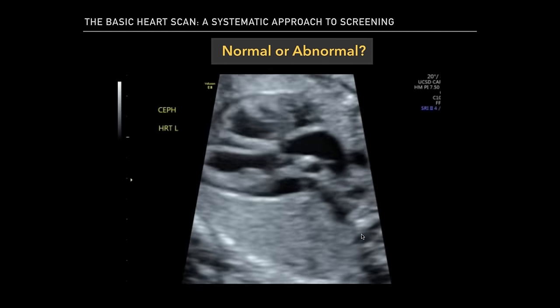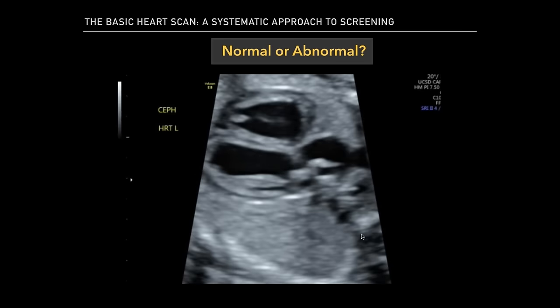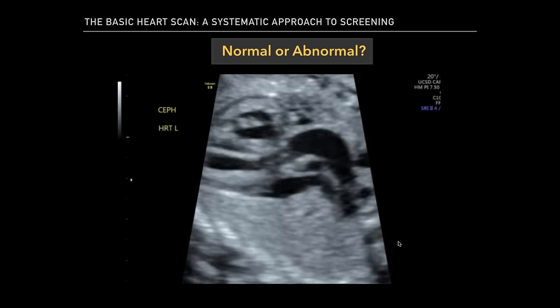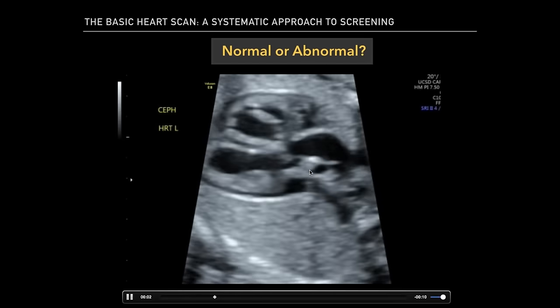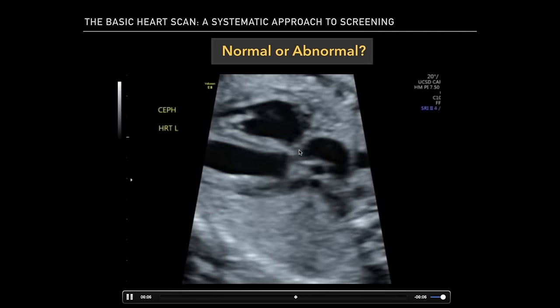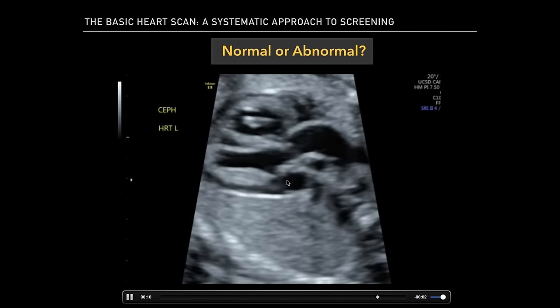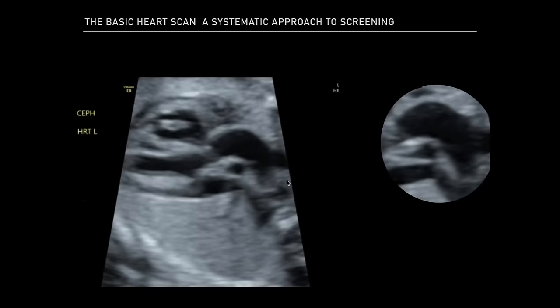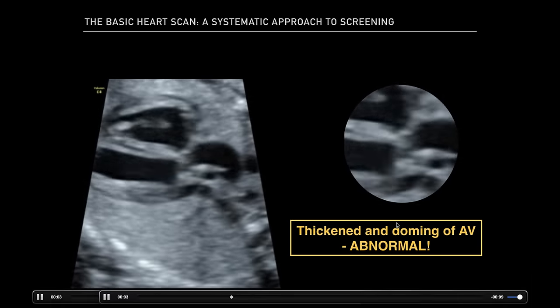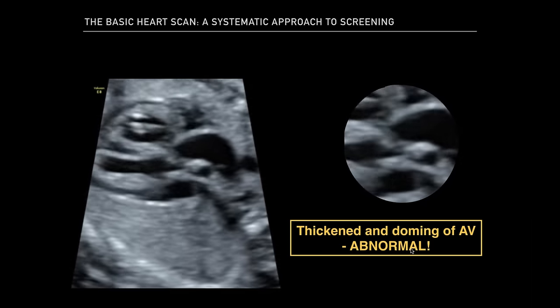So looking at this left ventricular outflow tract, is this normal or abnormal? Here we can actually see the valves, but it does not look like they're coming and going with the circulation, almost like they're staying in view. Now let's go ahead and get a closer look. So this ended up having thickening and doming of the aortic valve. So this is clearly abnormal.